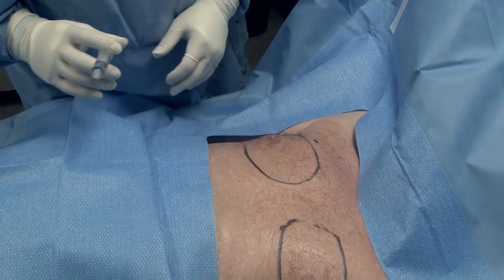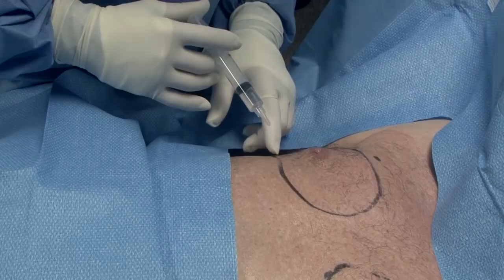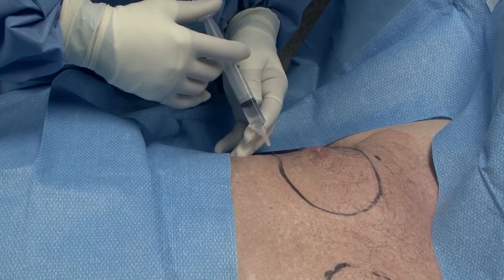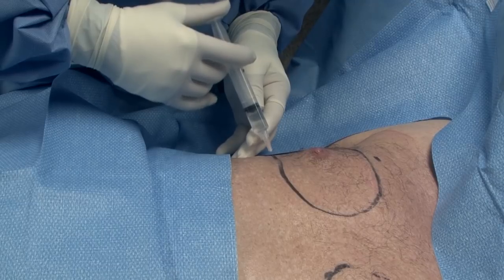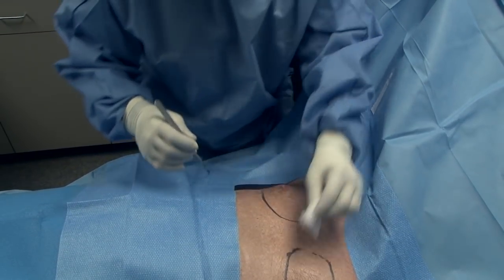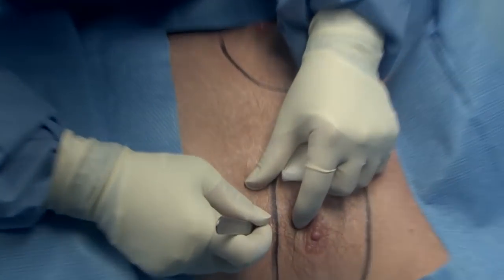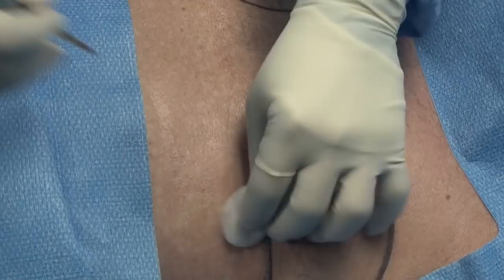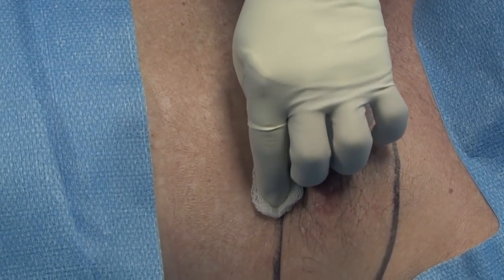The first step in the process is to numb one little spot that we're going to do all of our work through. You might have a tiny little opening that we made right there. That's so small that when we get done, we don't even put stitches in. We leave it open and it will close on its own within just a couple of days.